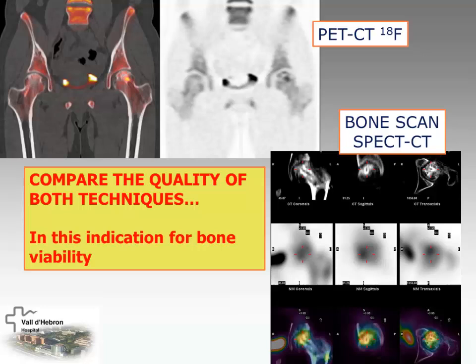On the right side, they perform just a forage without anything, and just the trauma can stimulate the bone neoformation. And on the left side, they perform the forage, plus they inject stem cells.